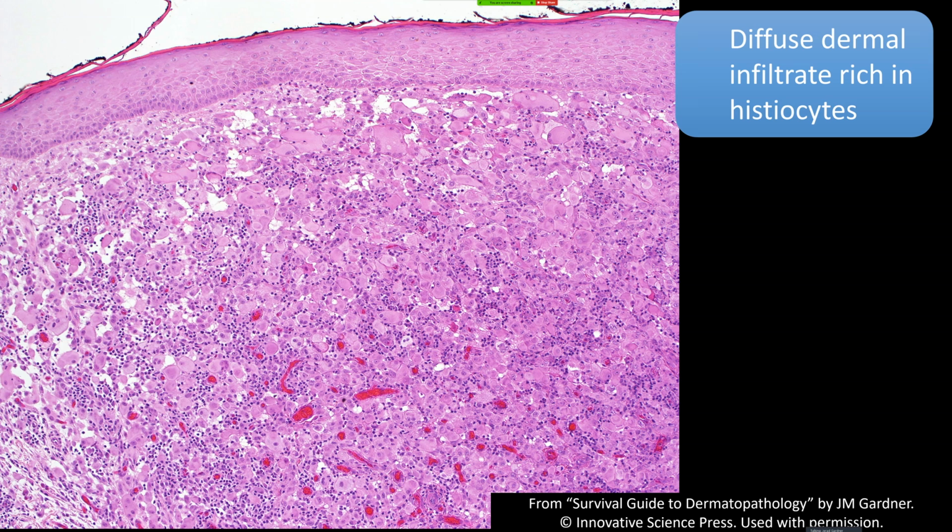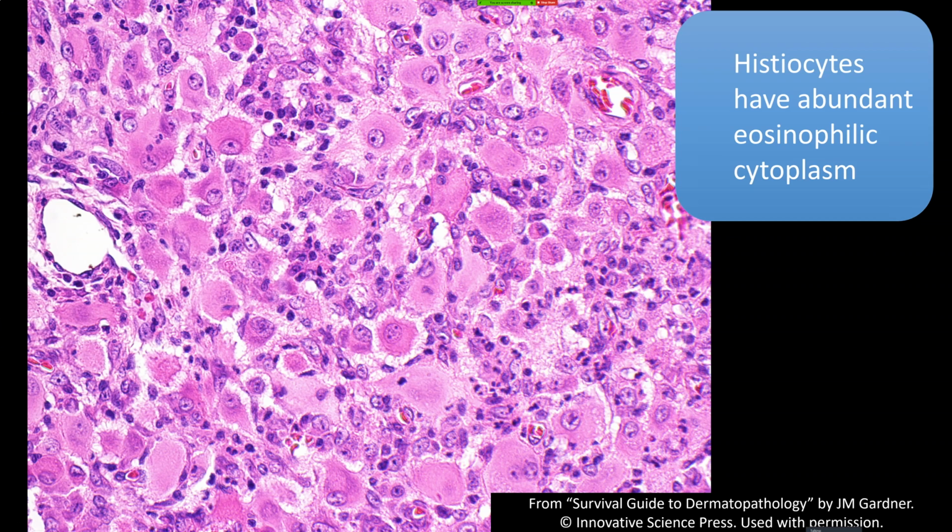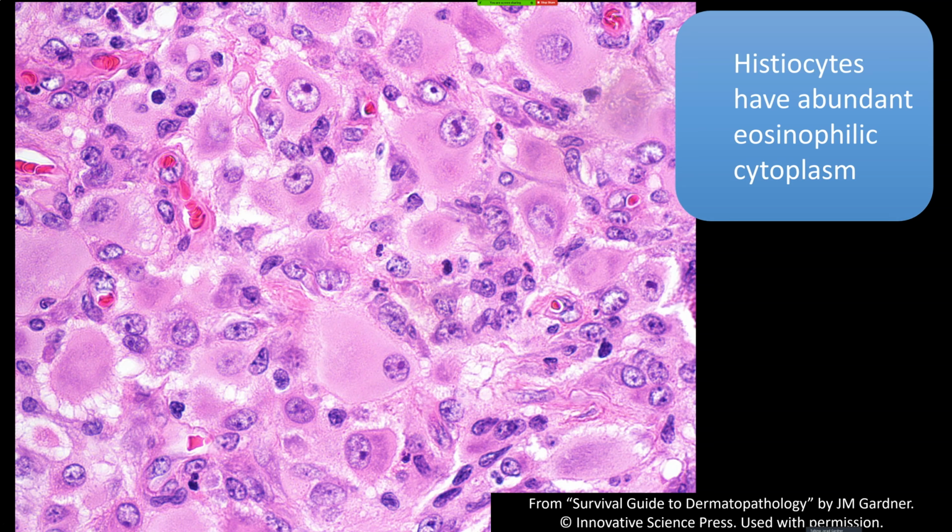So they do, even though I think they're probably two separate things, etiologically, I think that microscopically, they really have a spectrum of morphologic features that overlap. The thing I really like to see is the big epithelioid cells that have dense cytoplasm to them, okay? When I see those, that's what makes me call something a reticulohistiocytoma. If I really see few or none of those, and I see Touton giant cells and a lot of eosinophils, then I tend to call it xanthogranuloma, okay?